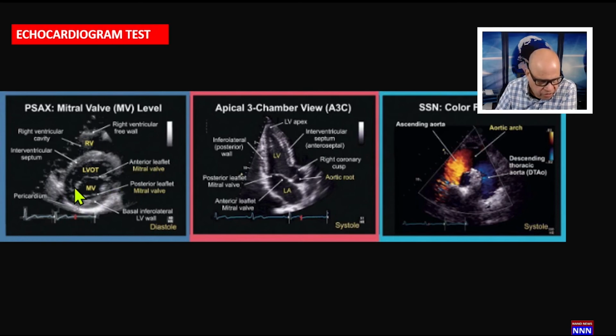But anyway, this is the anterior mitral leaflet, which is much larger than the posterior leaflet. We generally see the movement of the anterior leaflet more visible than the posterior leaflet, which just provides the support for the anterior leaflet to come in approximation.